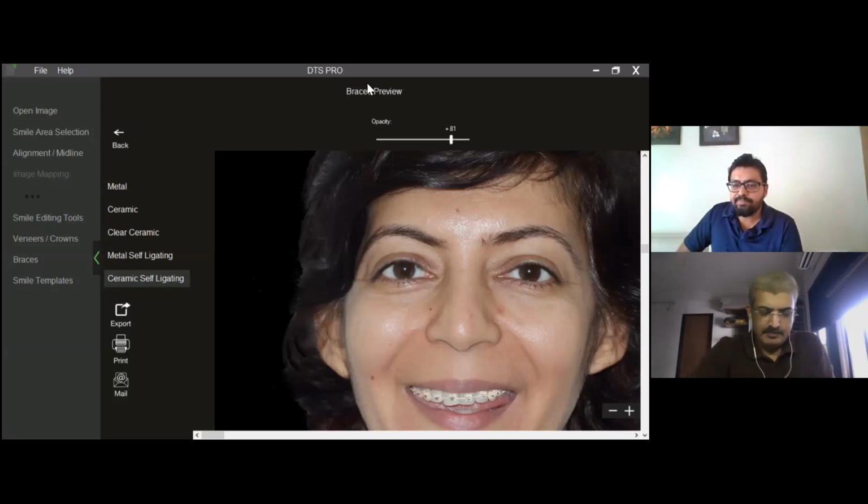Okay, Neeraj, I'm having a candid chat with you here. Absolutely, on this platform, and all are our own people. As you have all the angular things with you, we had a very nice talk on the same topic, but it was for the simulation of cephalometrics, by Dr. Milo Sherrington from Santiago, Chile. Now he was doing all the cephalometric analysis with PowerPoint and Keynote. Now your platform has everything.